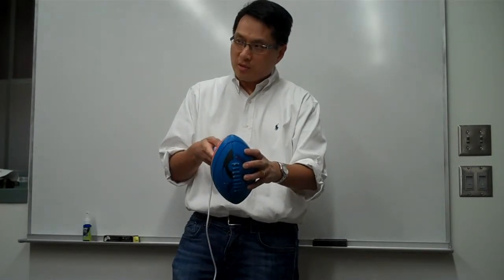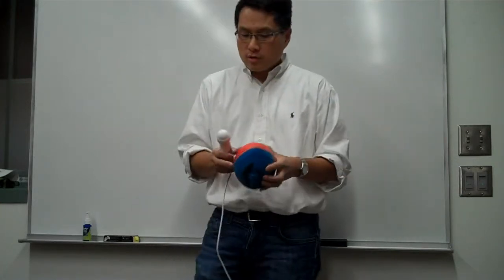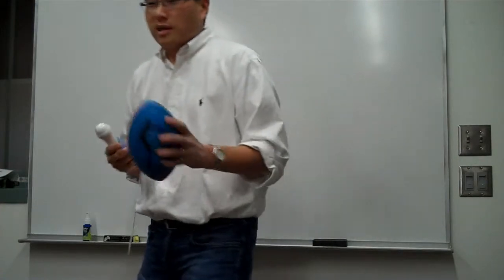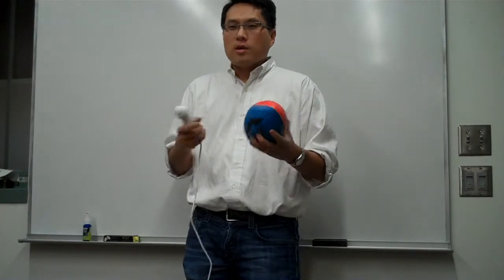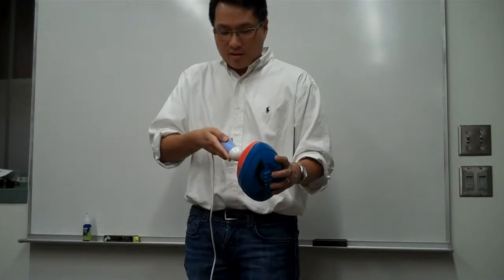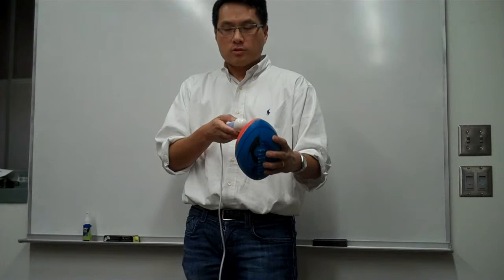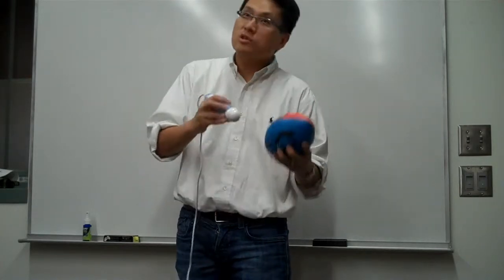It's a little complicated, but you guys kind of get what the point is. So now, how do we do that? Well, there are certain criteria. First, we want to scan something like a real baby, so the fetus has to be realistic. It has to be like a mannequin, so that when you actually scan, because we're going to be doing a live scan of the simulator, it actually looks like a real fetus. That's the first criterion, and it has to be scannable.